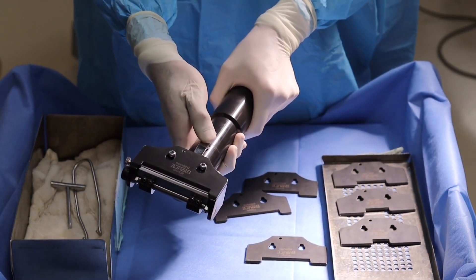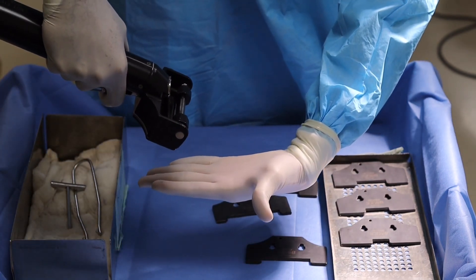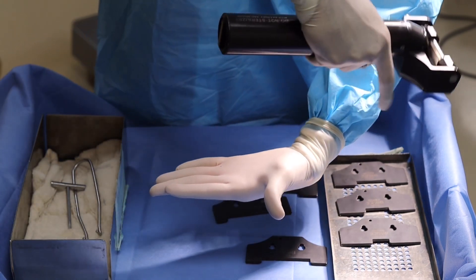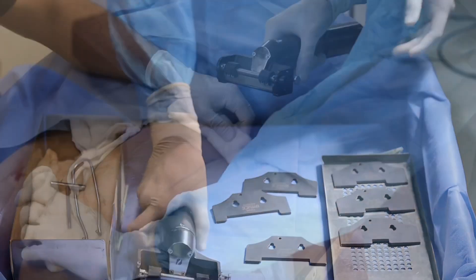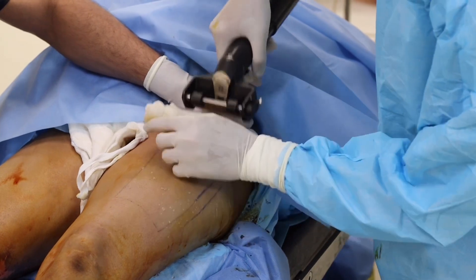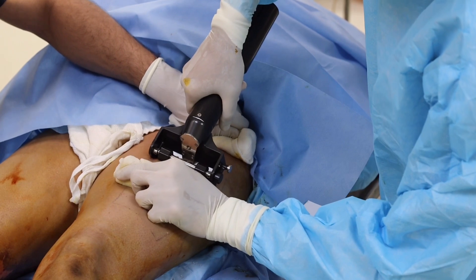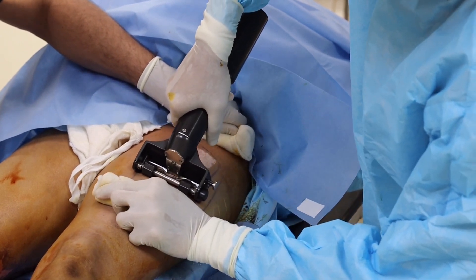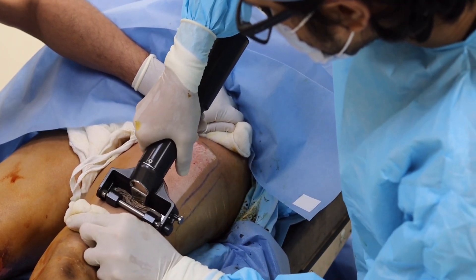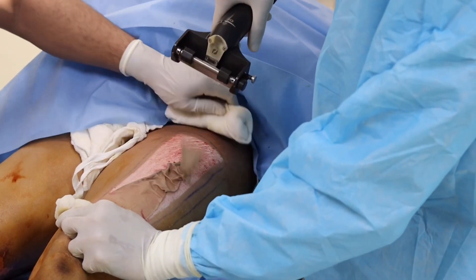We can see a switch; by pressing that, the dermatome will start working. While taking a graft, the dermatome should be placed at 45 degrees angle from the patient's thigh and we should proceed slowly, elevating the sheet of the graft. As I am a right-handed surgeon harvesting the graft from the patient's left thigh, the graft will be harvested in the proximal to distal direction. An assistant will be providing traction proximally and the distal traction will be provided by the surgeon's left hand, placed a few centimeters distal to the dermatome. As the graft is elevated, the left hand will proceed distally providing continuous traction until sufficient length of the graft is harvested.